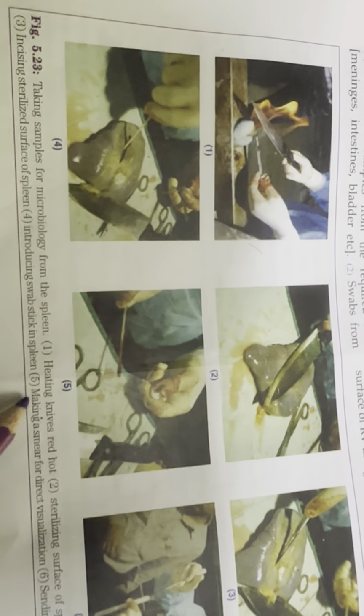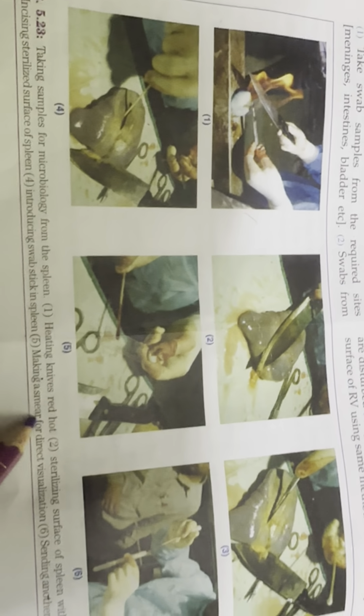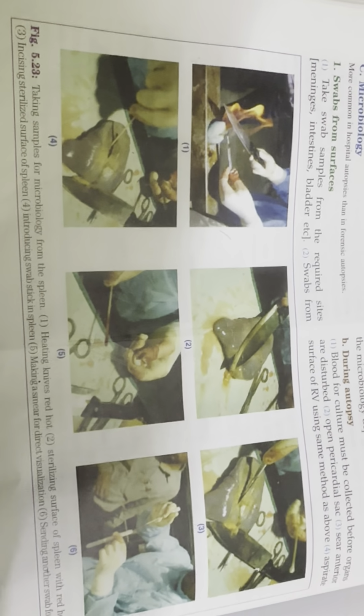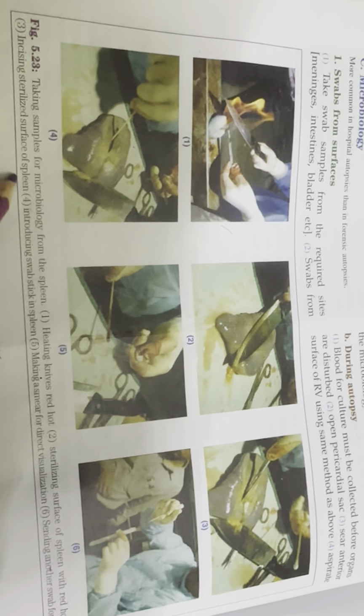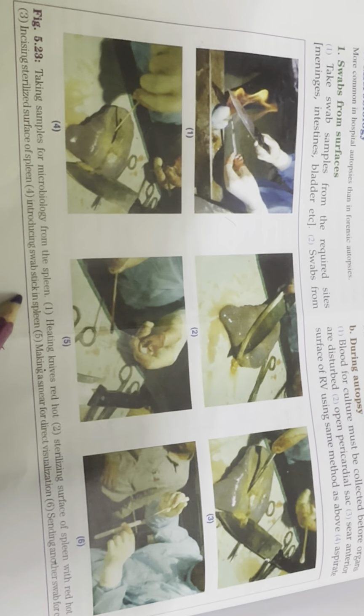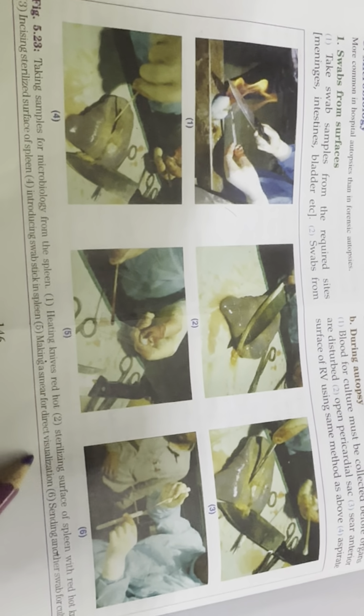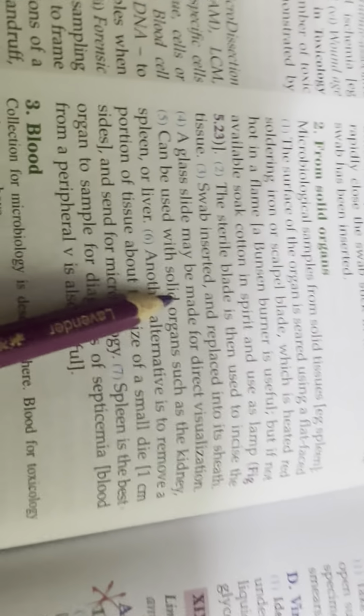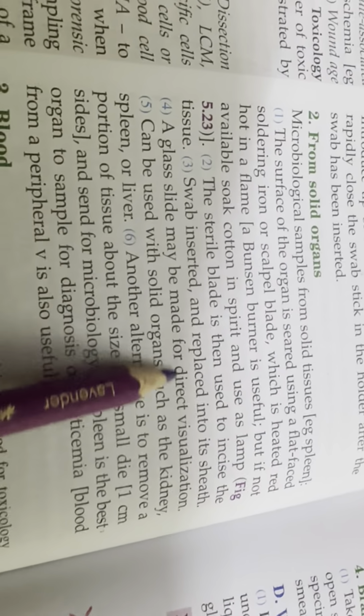Figure 5.23. Take samples for microbiology from a spleen. Heating knives red hot, sterilizing the surface of the spleen with a red hot knife, incising the sterilized surface of the spleen, introducing a swab, sticking it in the spleen, making a smear for direct visualization, and sending another swab for culture. Swab insert and replace into the sheath.